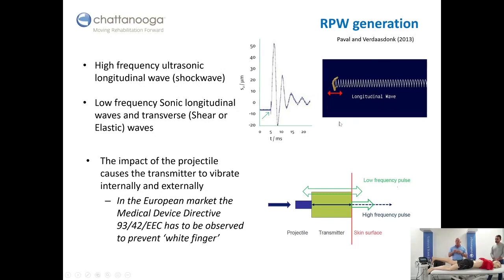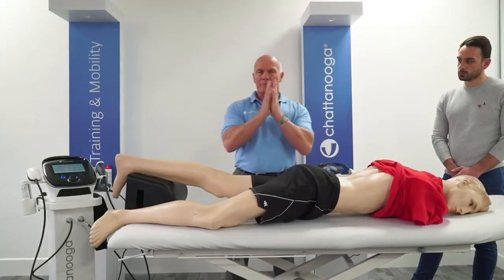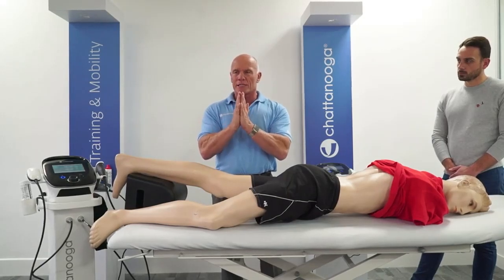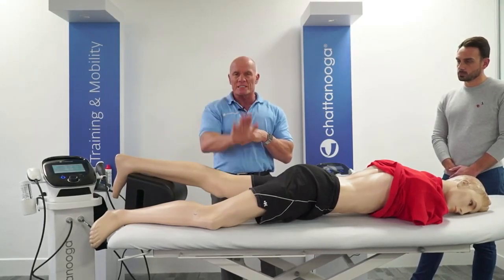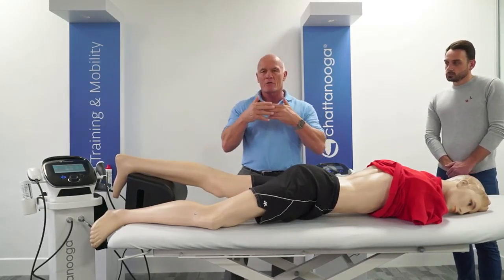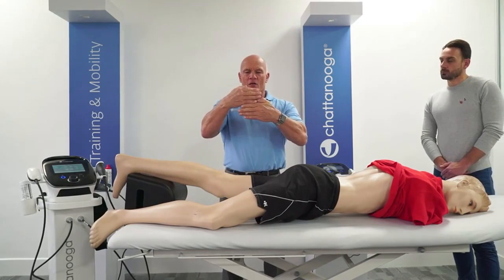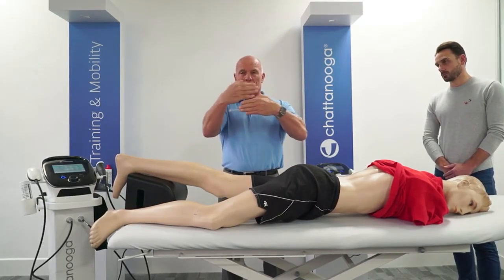Okay, so a longitudinal wave compresses pressure as it goes through. It starts like this, and so we get compression, and that's important when we get onto the biological aspect. But we also get this shear or transverse wave, where it's travelling like this, up and down. Now, that has an effect on the tissue to force it this way, to move.